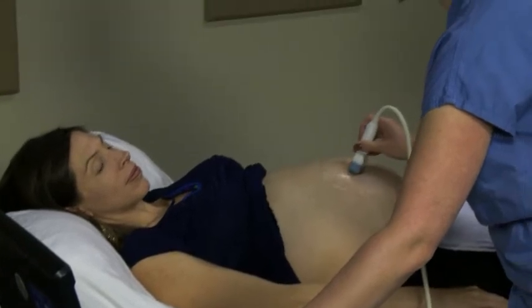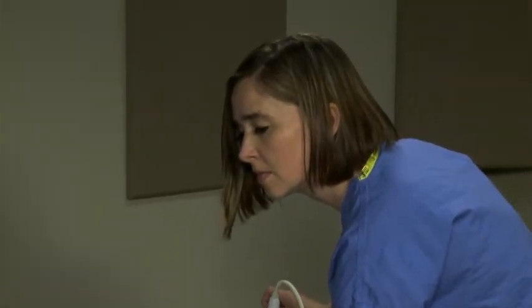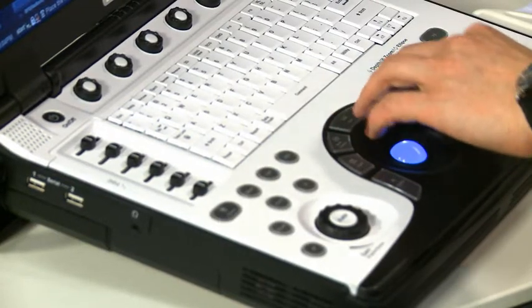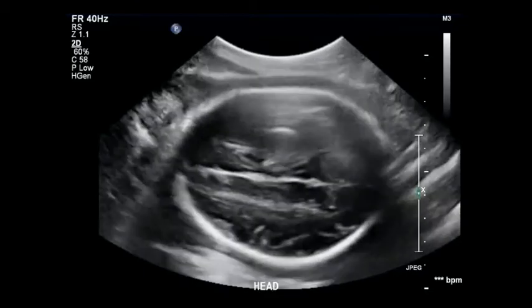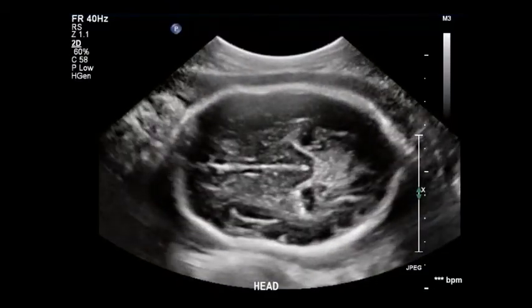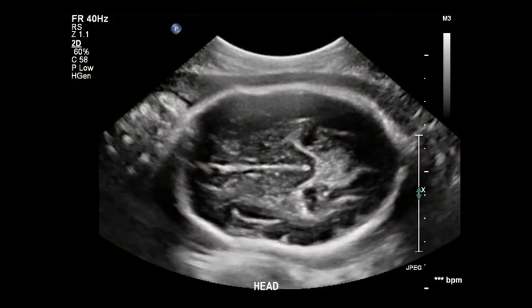When you scan the fetus to measure the biometry, it is important to get the best picture you can before measuring. The time spent getting a good picture will increase the accuracy of your measurements. First, find a good place to measure the BPD and HC — both can be measured in the same image. The BPD measures the width of the head; the caliper is placed outside the bone for the first measurement and inside the bone on the second. Once you have measured the BPD, measure the HC on the same image by placing the circumference on the outside of the skin. Important landmarks you should see are the thalamus, which is heart-shaped, and the CSP. After getting accurate measurements, store the image on the ultrasound machine.